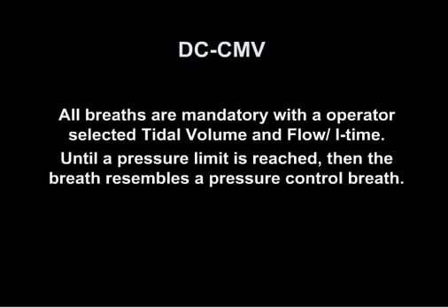Now, with dual control continuous mandatory ventilation, all breaths are mandatory with an operator selected tidal volume and flow/I time until a pressure limit is reached. Then the breath resembles a pressure controlled breath.